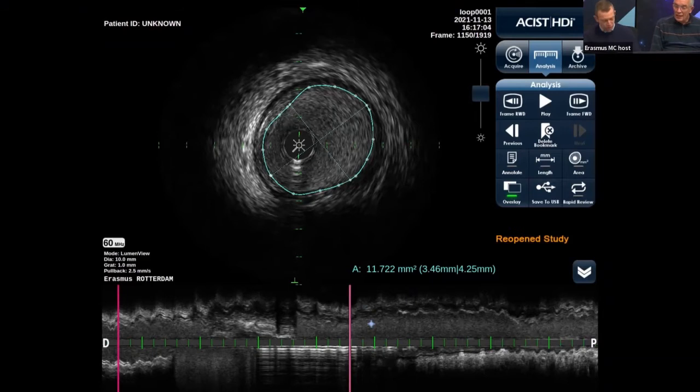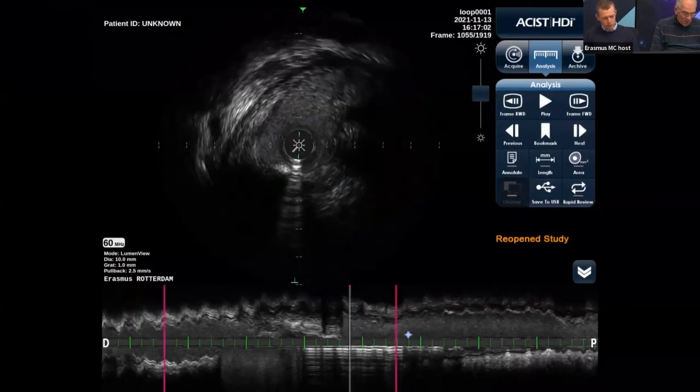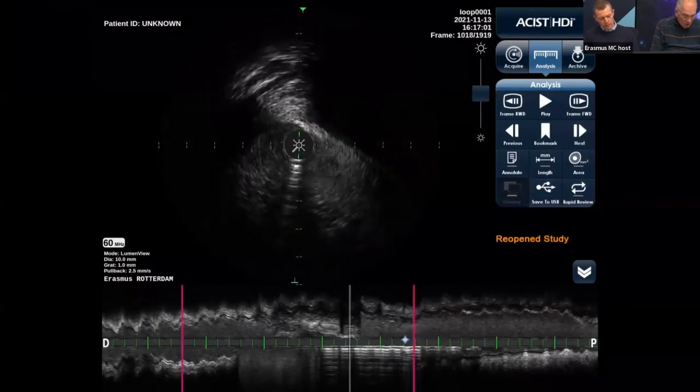Anyway, besides this small sidestep, we found an aneurysm with a diameter that we could not even measure. But we also saw a plaque rupture just at the neck of the aneurysm. Let's go back, then I can show you.